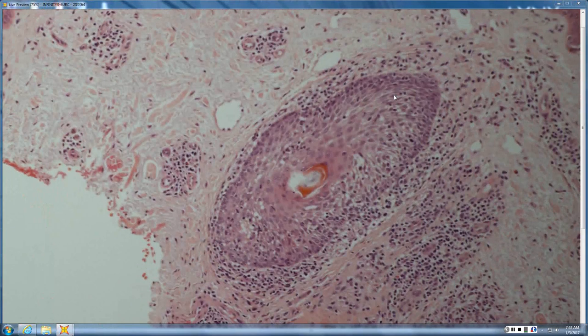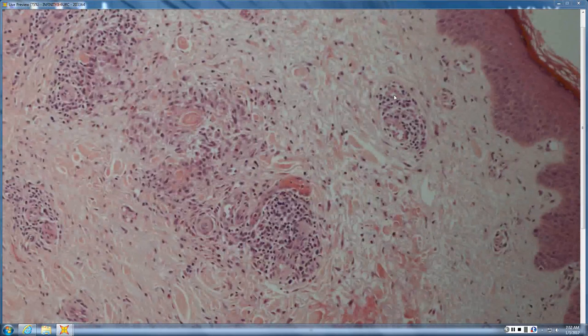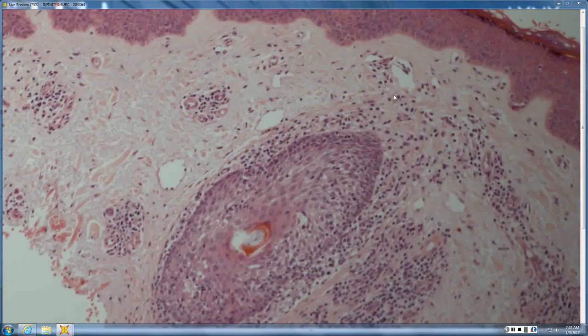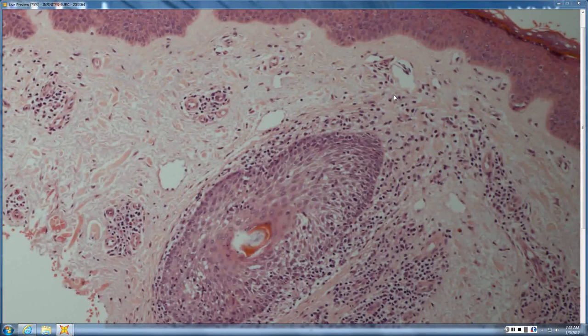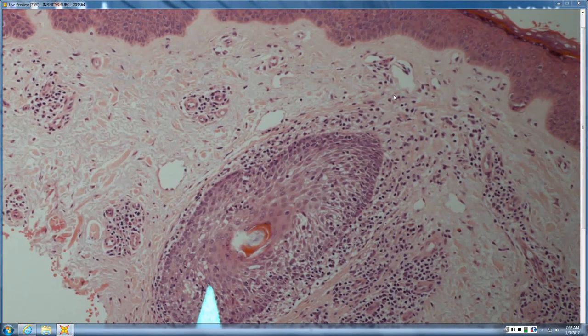There's a lymphoid infiltrate involving the isthmus of the hair as well as the sebaceous gland. So I would consider this to be lupus, even though there's not a lot of vacuolar lichenoid infiltrate at the top, so more of a DLE-like picture. Yeah, there are a lot of eos here as well, which would go a little bit against lupus. It's also, I'd say, more spongiotic than interface.